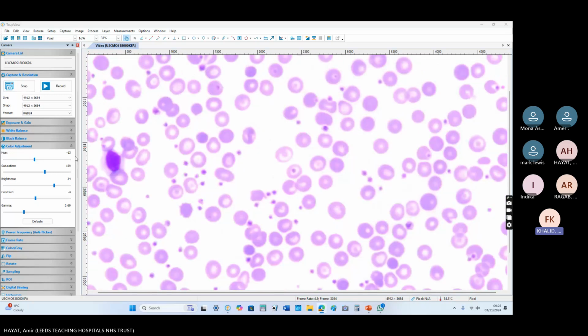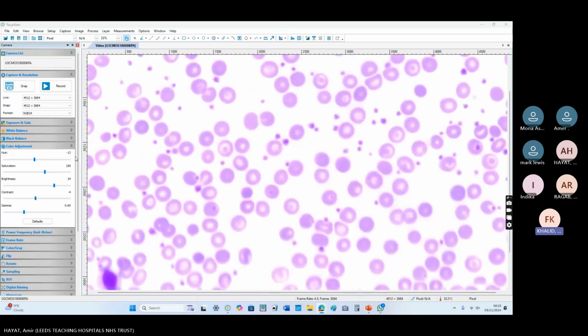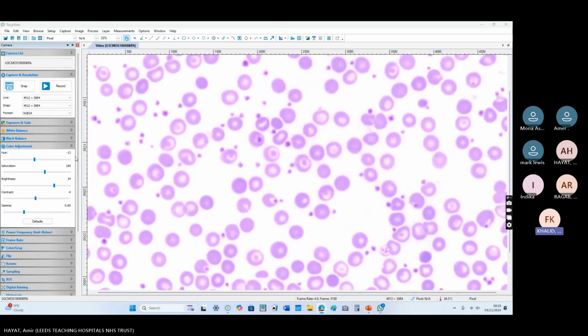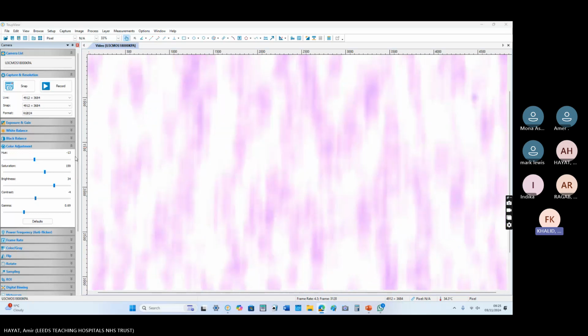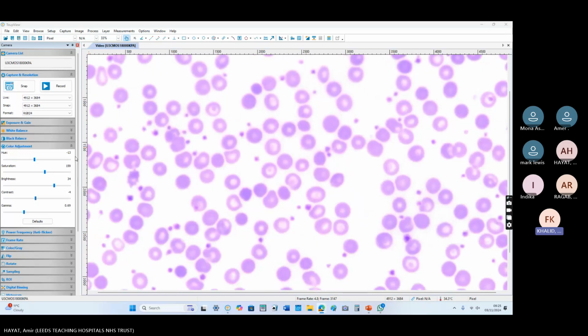So then this is thrombocytosis until proven otherwise, in the context of an infection or a viral illness. So what I would suggest is three things. First, I will say this is thrombocytosis. There are spherocytes in there, and in the context of the history of viral infection, I would say first do hematinics, B12, folate, and rule out infection.